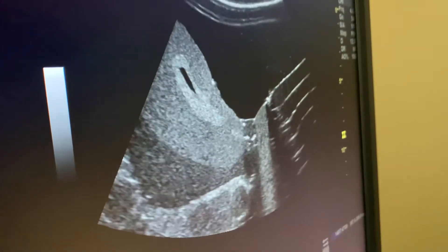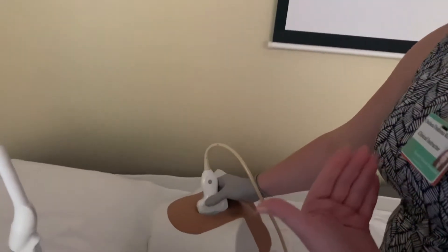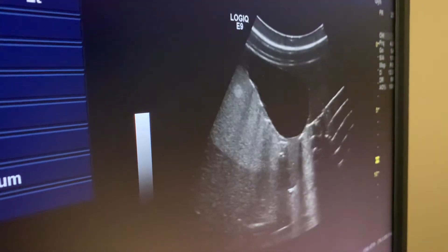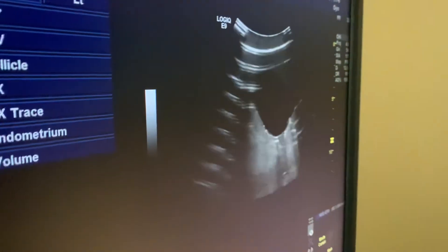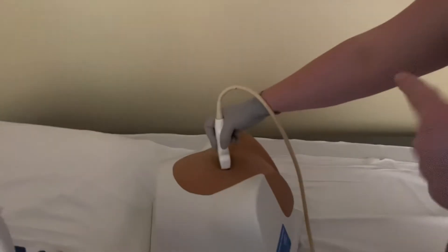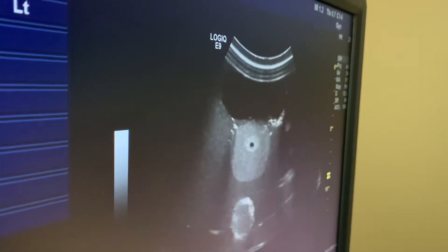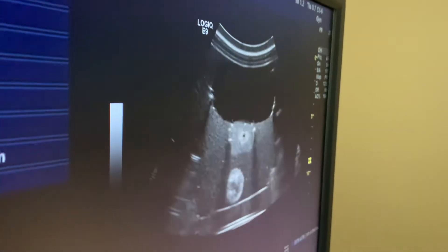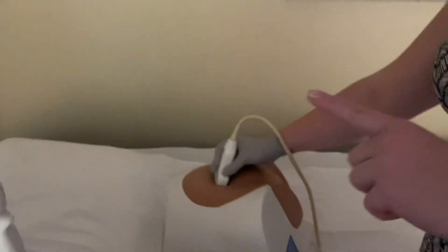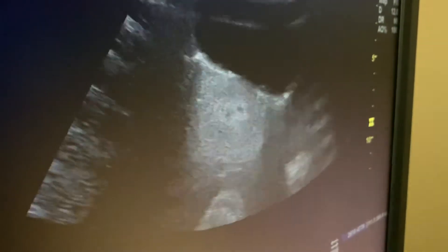If I'm in sagittal and sweeping to the patient's right, that's what I'll see on my screen — to the right of the uterus. If I sweep to the left, I see the left of the uterus. Now if I turn the probe to transverse, with the notch towards the patient's right, the seesaw goes right and left, not superior and inferior. Moving the probe up goes towards the fundus and down towards the cervix.